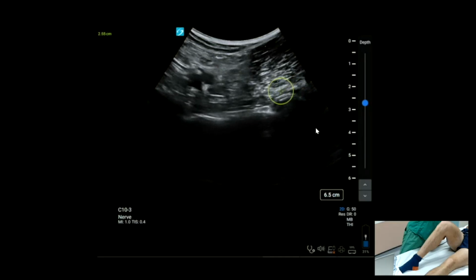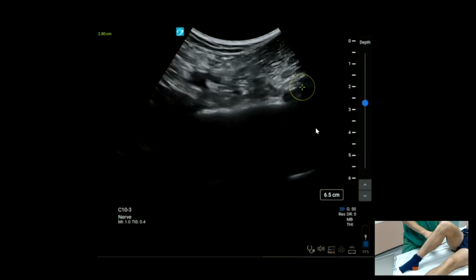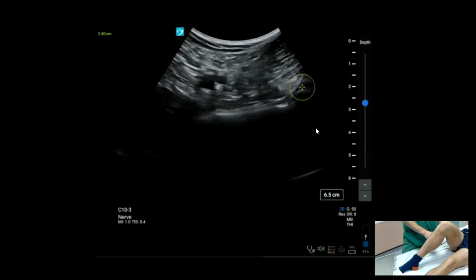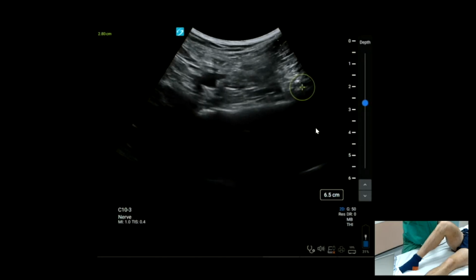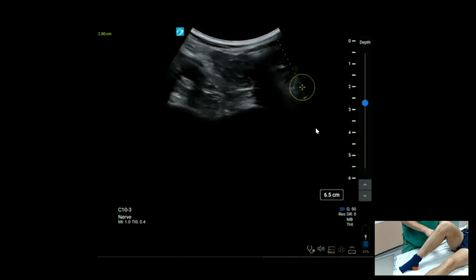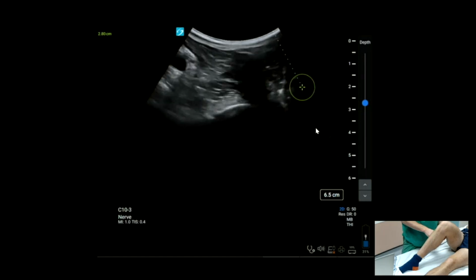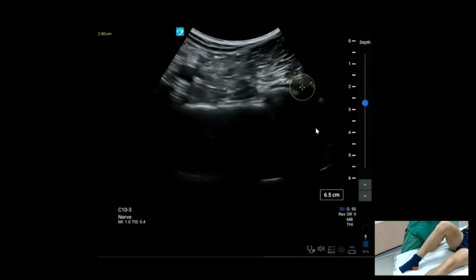So this is a motor sparing technique, and it's no different really to the surgical local infiltration analgesia that occurs, except we're hopefully putting it in the right place under guidance and thinking about it. That's the main attraction of doing it. It's really simple. Probe on like that, condyles of the knee, flatten your probe off again, and then I tend to do 3 passes.